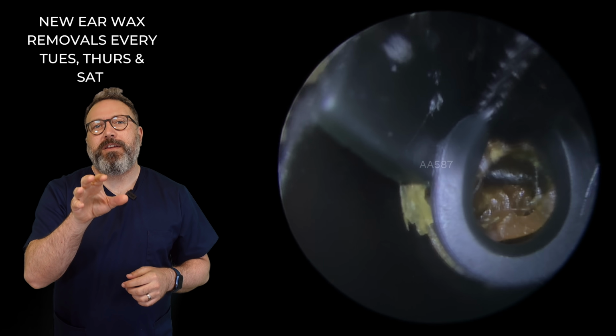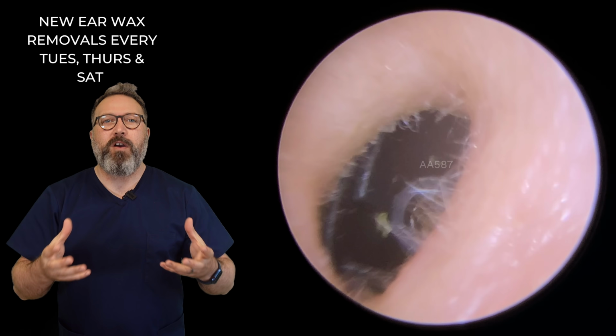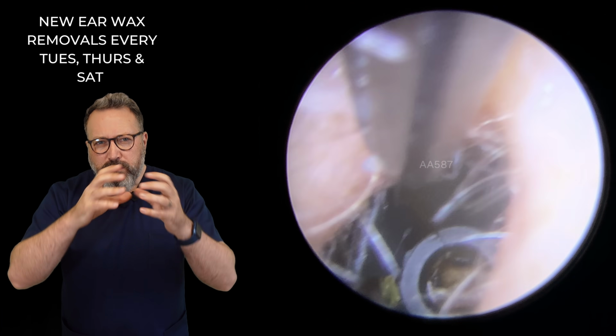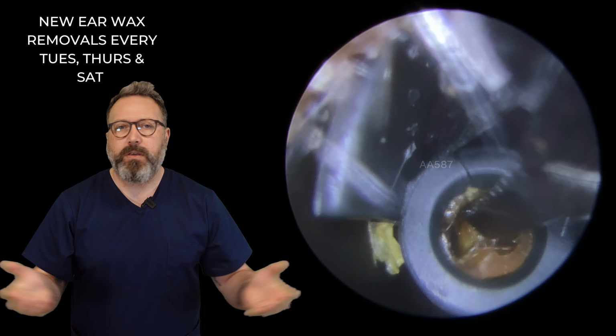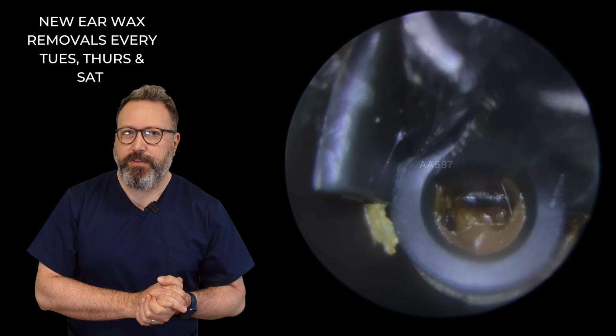So we're just removing this particular foreign body. You can see it's made of rubber. It's quite kind of dome shaped. It's got this little hole in the middle of it. So what do you think this could be, guys? What do you think it's for?